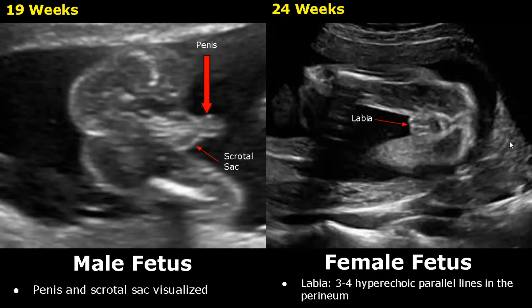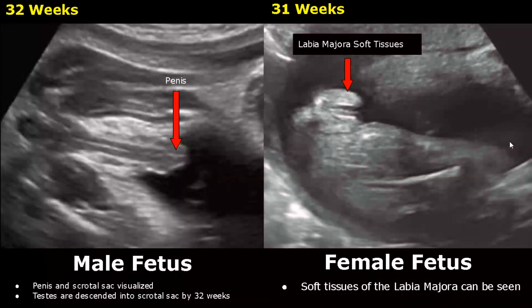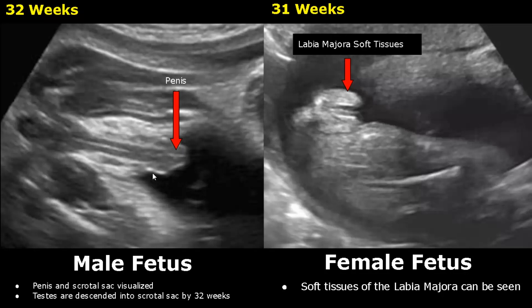Usually by 32 weeks in a male fetus, the testes will descend into the scrotal sac and they can be visualized. In this image, however, we do not see the scrotal sac, but we can see the male genitalia.